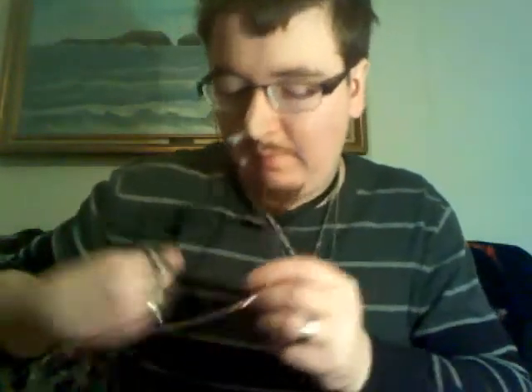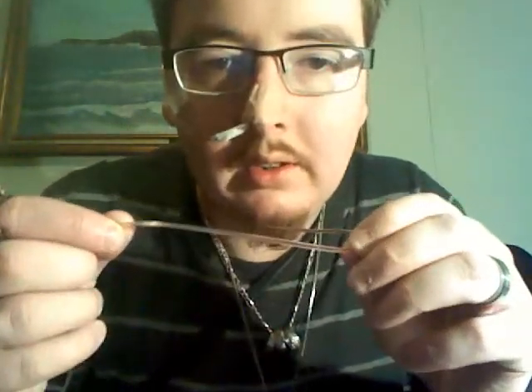So every meal that I ate today, which was very little, next to nothing like usual, and even when I drank, I had to chew so small, because every time I swallowed it would stick there because of the tube. It is a very small tube, you can see it up close.